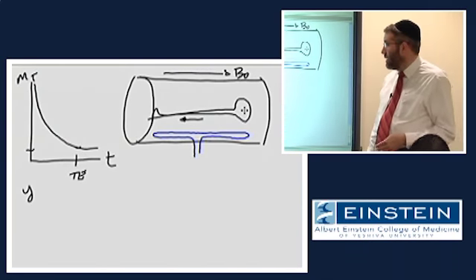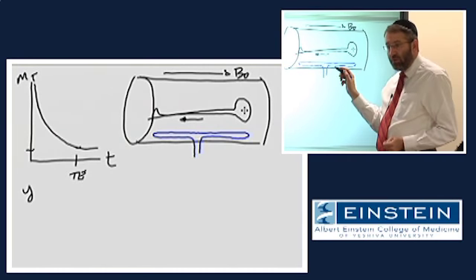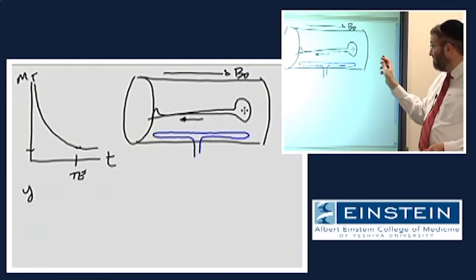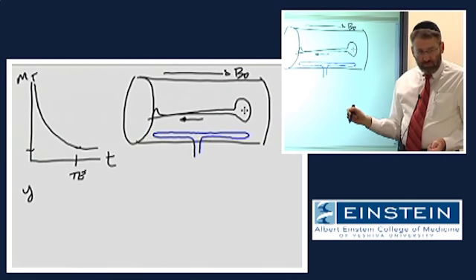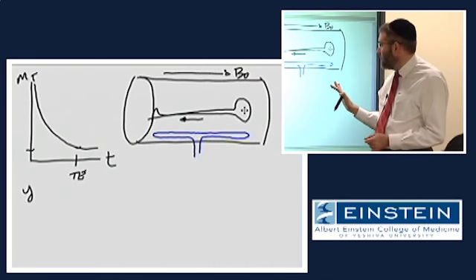Basically, it is sensitive to whatever magnetization might be precessing in the transverse plane anywhere in the bore of this scanner. This isn't such a good real-life example, but it makes things easy for us.